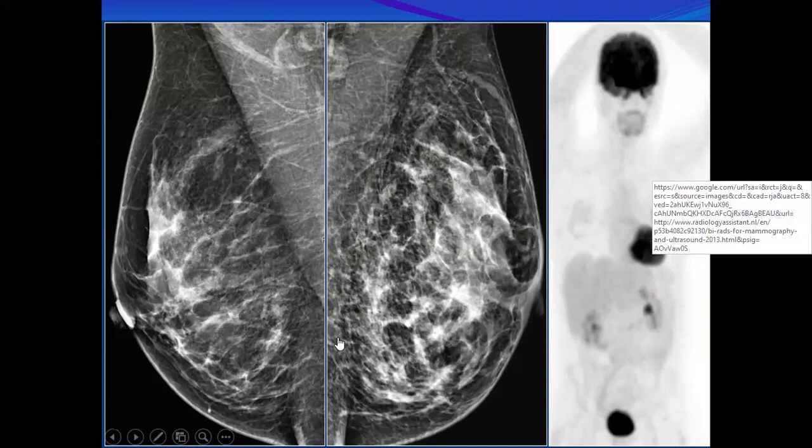But what is the name for the small breast with suspicious features? We call it, what would we call it? What will happen to the breast if it becomes infiltrated by malignancy? There will be skin change, orange skin, red, orange, shrunken skin. Excellent. Who said that?